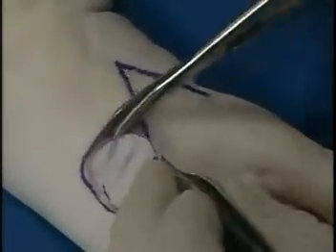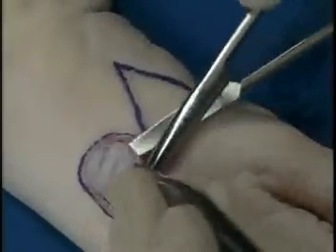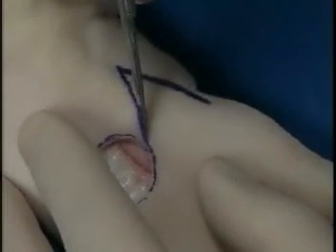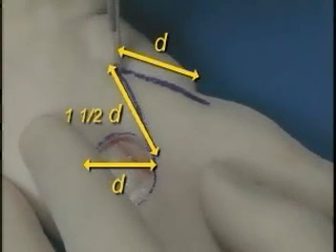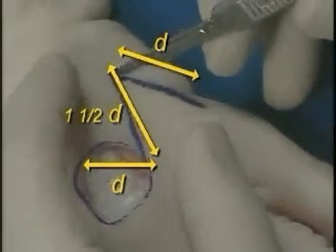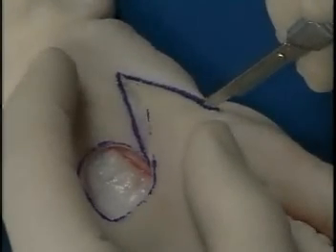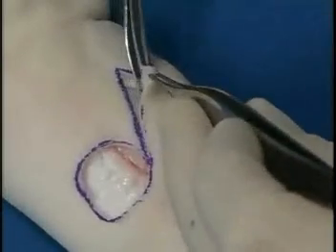Here we see the lesion being excised. Once this lesion is removed, the other limbs of the note flap are drawn. There's the first limb. It's approximately 1.5 times the diameter as a tangent. And the second limb is now cut. That is the diameter of the lesion at approximately a 60-degree angle.